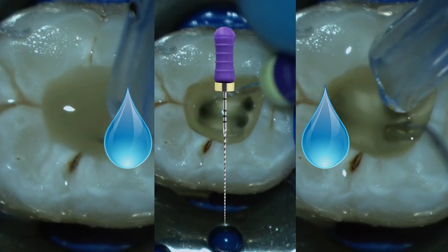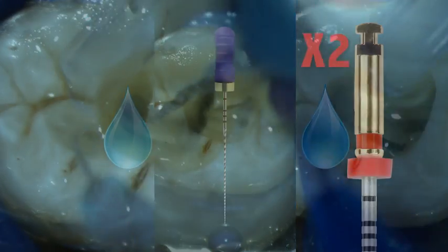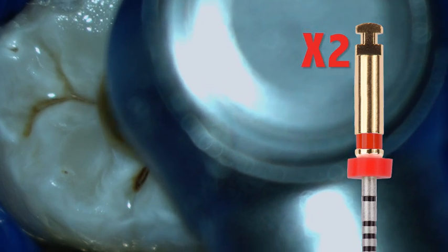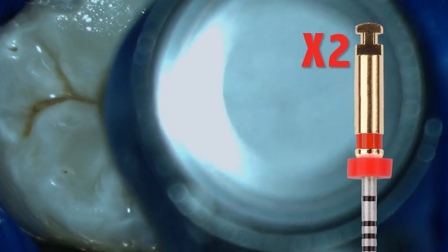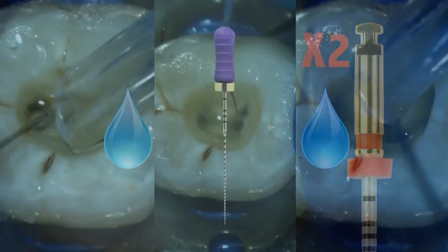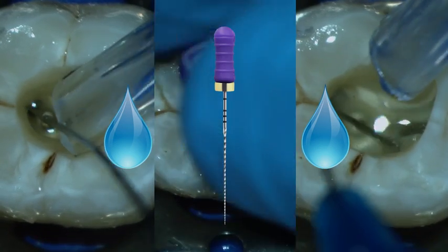Following the use of the X1, the canals are recapitulated with the number 10K file and irrigated with copious amounts of sodium hypochlorite. The next instrument in the ProTaper Next sequence is the X2. It is also used in a push-pull fashion over short amplitudes of 1 to 2 millimeters. It may also be noted that the use of these files produces a churning effect or turbulence. This facilitates the removal of dentin debris and the cleaning of the canals. Following the use of the X2, recapitulation with a number 10K file and irrigation with sodium hypochlorite is again indicated.